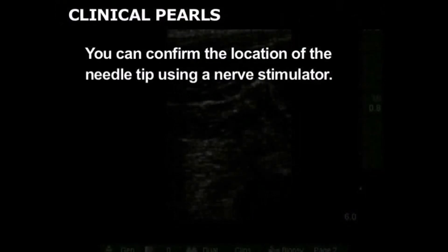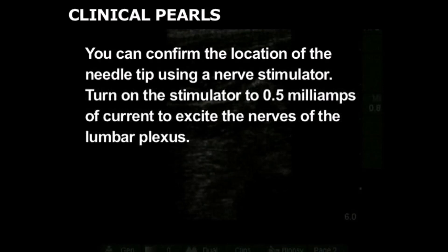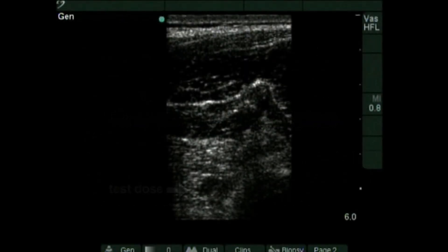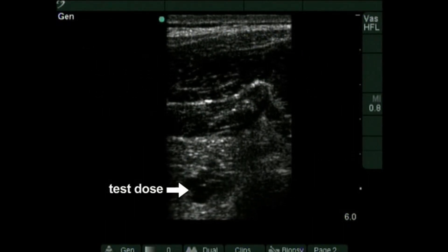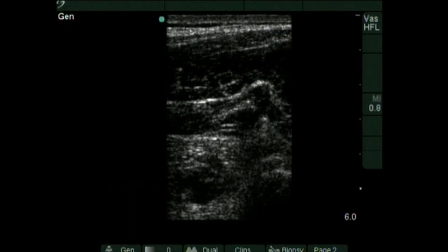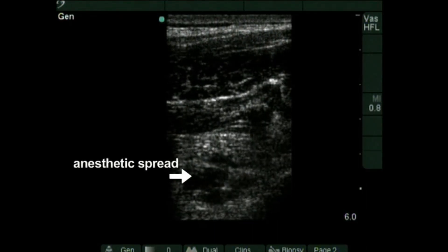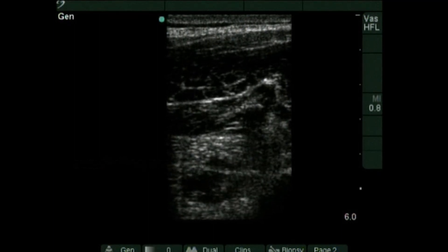You can confirm the location of the needle tip using a nerve stimulator. Turn on the stimulator to 0.5 milliamps of current to excite the nerves of the lumbar plexus. Activation of the femoral nerve causes the quadriceps to twitch, indicating that the needle is correctly located. Aspirate the syringe and inject a test dose of 1-2 milliliters of anesthetic, looking for medication spread on the ultrasound screen. A small expanding hypoechoic area should be well visualized. If you cannot appreciate the injection on the screen, stop immediately. If the test dose indicates correct needle placement, an additional 18 milliliters of anesthetic is administered. Continue to watch the screen to monitor the injection.